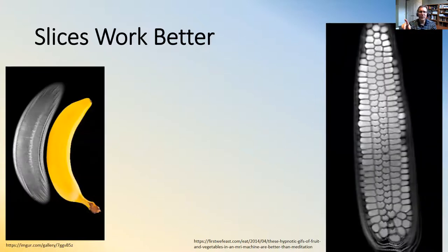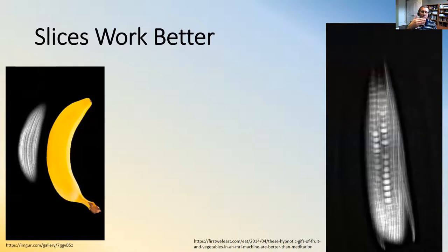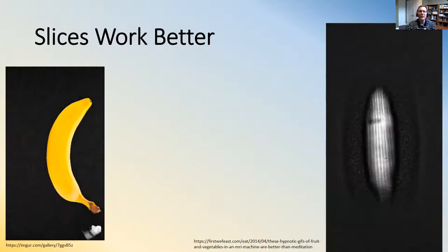And so that physician, with her mouse wheel, can stop at any slice she wants. Look at the surface, look inside, look underneath it. It's no problem. It's just an easier way to see it. Then they build up a map in their mind.